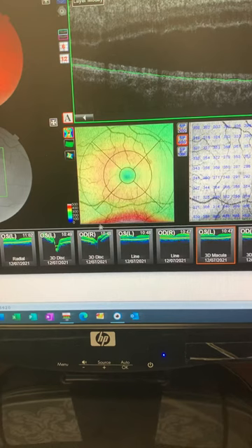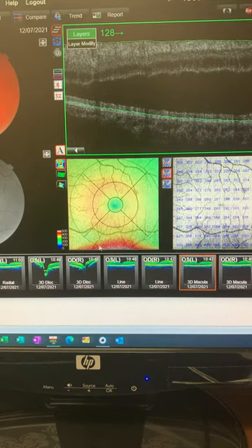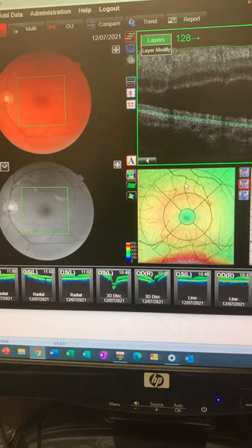If we go to the heat map down here, we can see that this little hot spot — this raised area — is commensurate with the splitting of this retinal layer. It's worth noting that whenever you've got an issue in the bottom edge of the retina, you perceive it as a problem in the superior field, which is why this gentleman has damage in the inferior aspect but notices the problem in the top part of his vision.